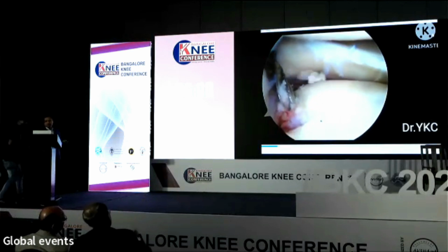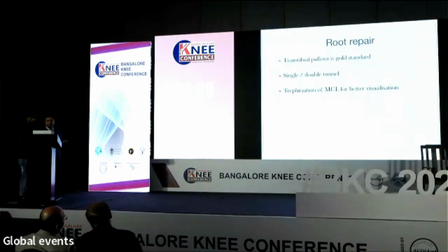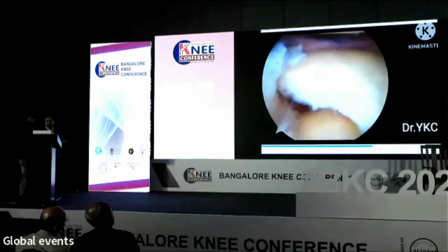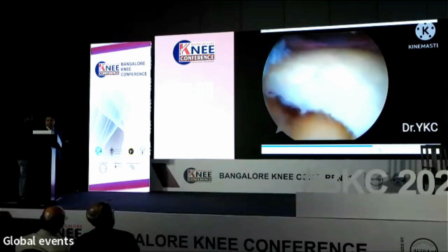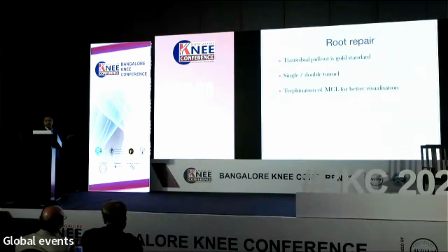Fast forward, fast forward. Okay, I think I cannot fast forward this video. I'll just skip the video. So transtibial pullout is the gold standard, either single or double tunnel.